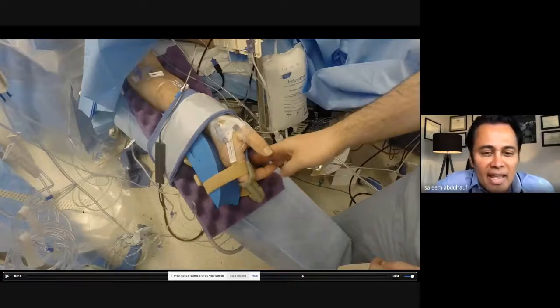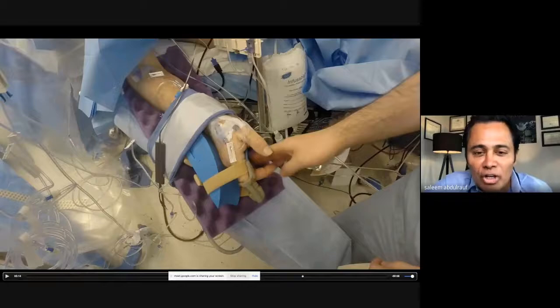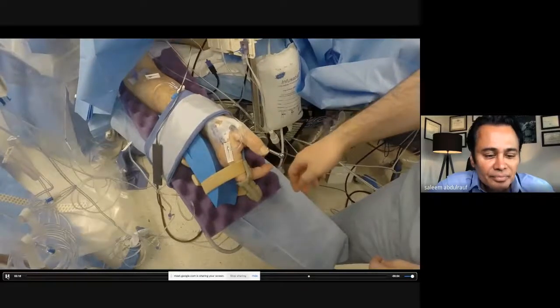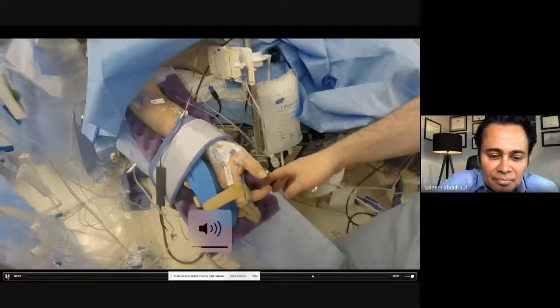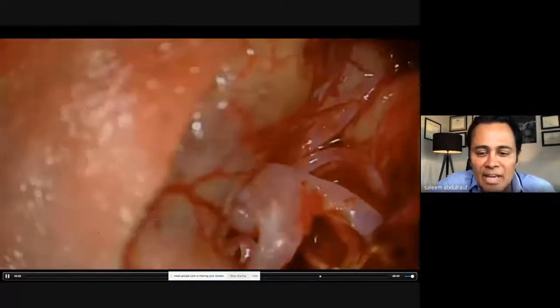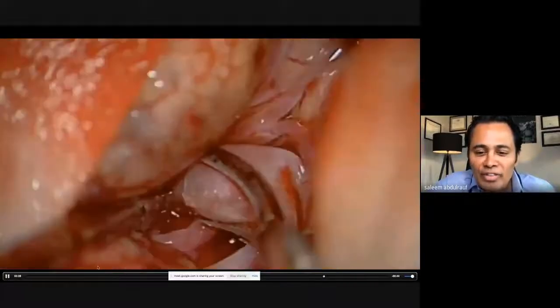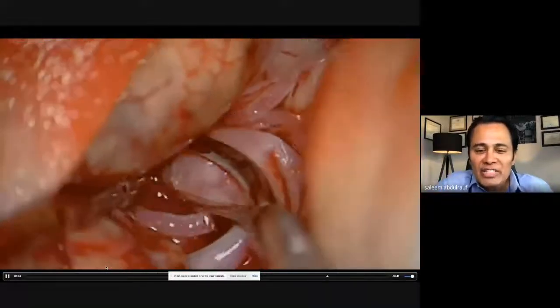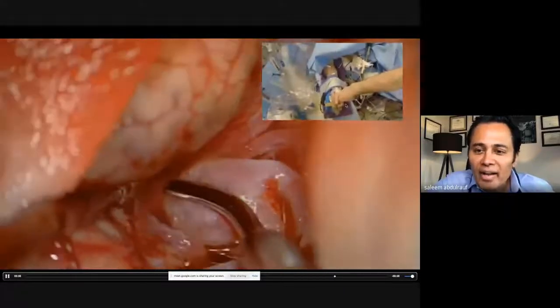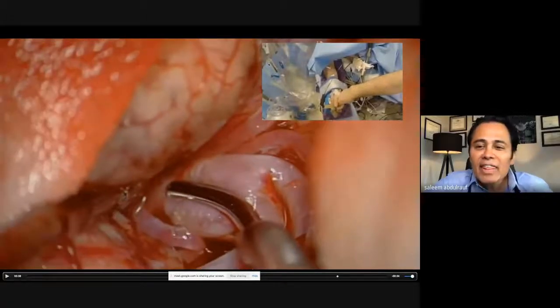Okay, EEG, SSEP completely normal. Motor evoked potential, 100% normal. Okay. Fingers, Terry? He's not moving his fingers. Okay, I immediately say, give me the temporary clip remover. I remove the temporary clip. He is starting to squeeze his hand right away, within a second. Right here, you see right away. Excellent. Nothing changed: EEG, SSEP, motor evoked potential.